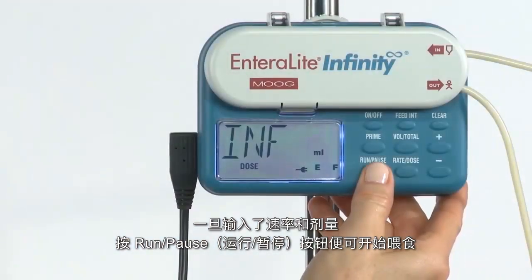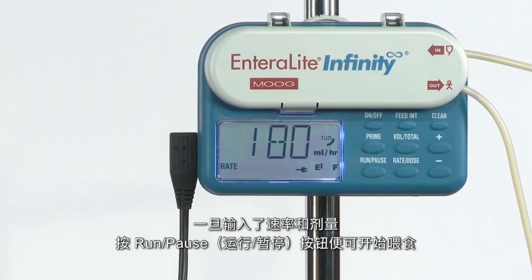Once your rate and dose have been entered, press the run pause button to initiate the feeding.